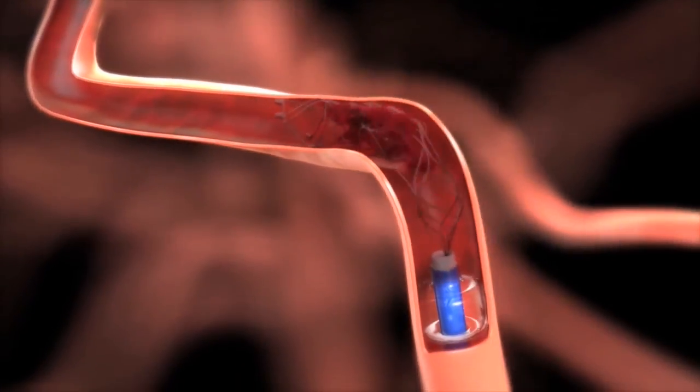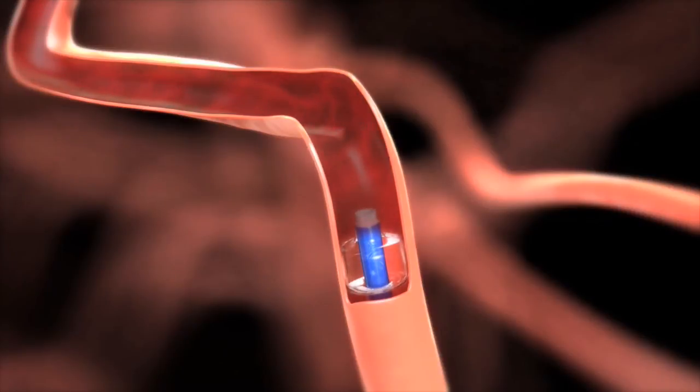The purpose of inflating the balloon in the carotid artery in the neck is to reverse flow from the brain arteries and into the catheter out of the patient's body. In this way, any particles that break off from the blood clot within the stent retriever will get sucked out of the patient's body. They don't go out distally and cause more strokes.